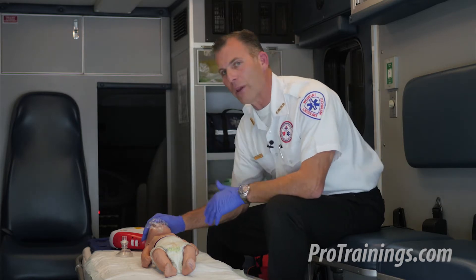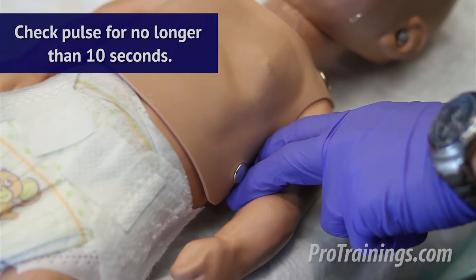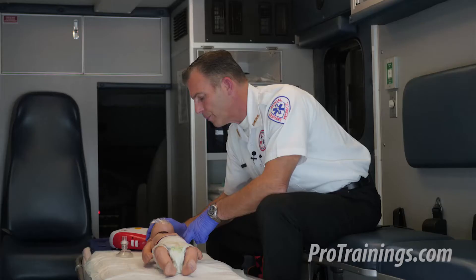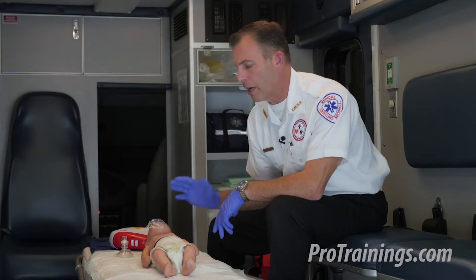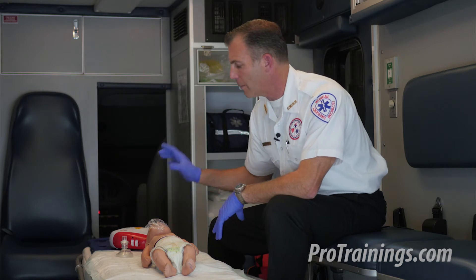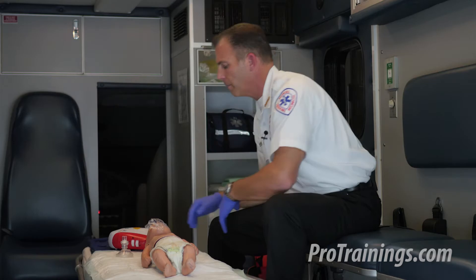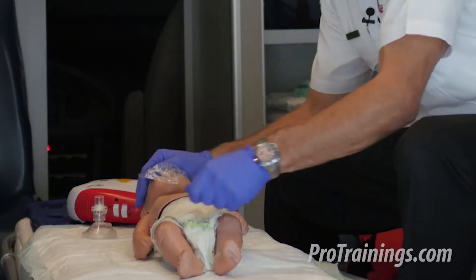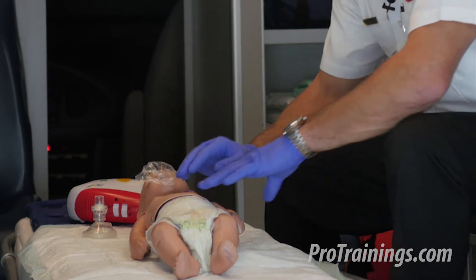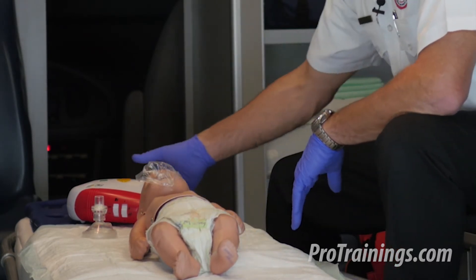I'm going to assess the baby for normal breathing and check for a pulse for no more than 10 seconds on the brachial artery. The baby does not have a pulse and is not breathing normally, so because I have an AED here, I'm going to go ahead and use it immediately by turning it on. I strip the clothing down over the chest and back to reveal them, dry off if needed, and the area is now prepared for the AED pads.